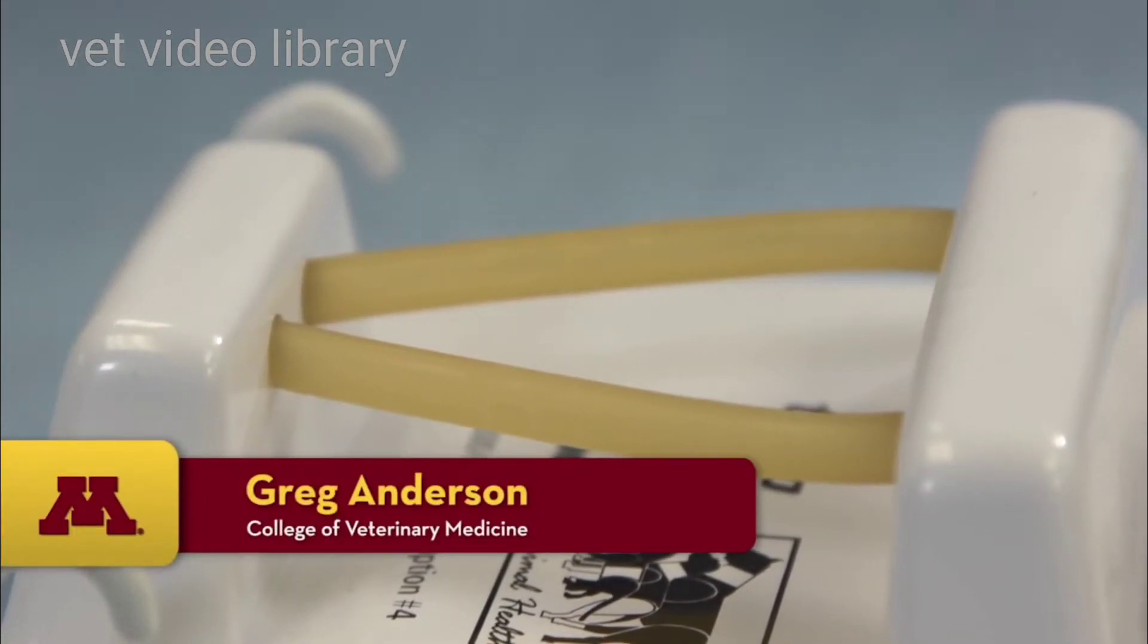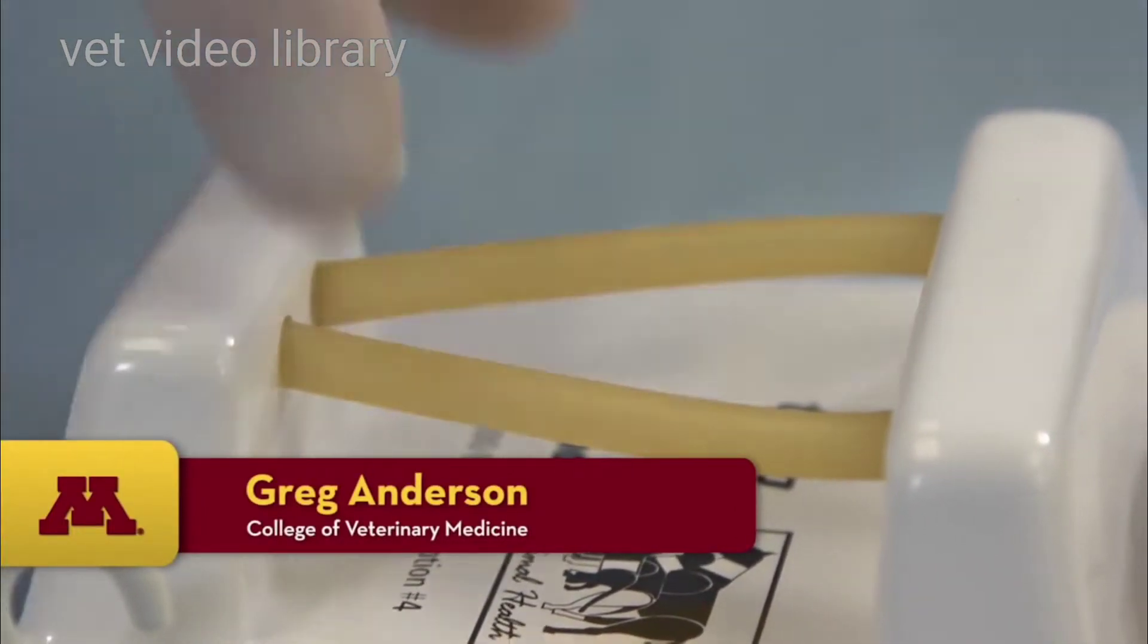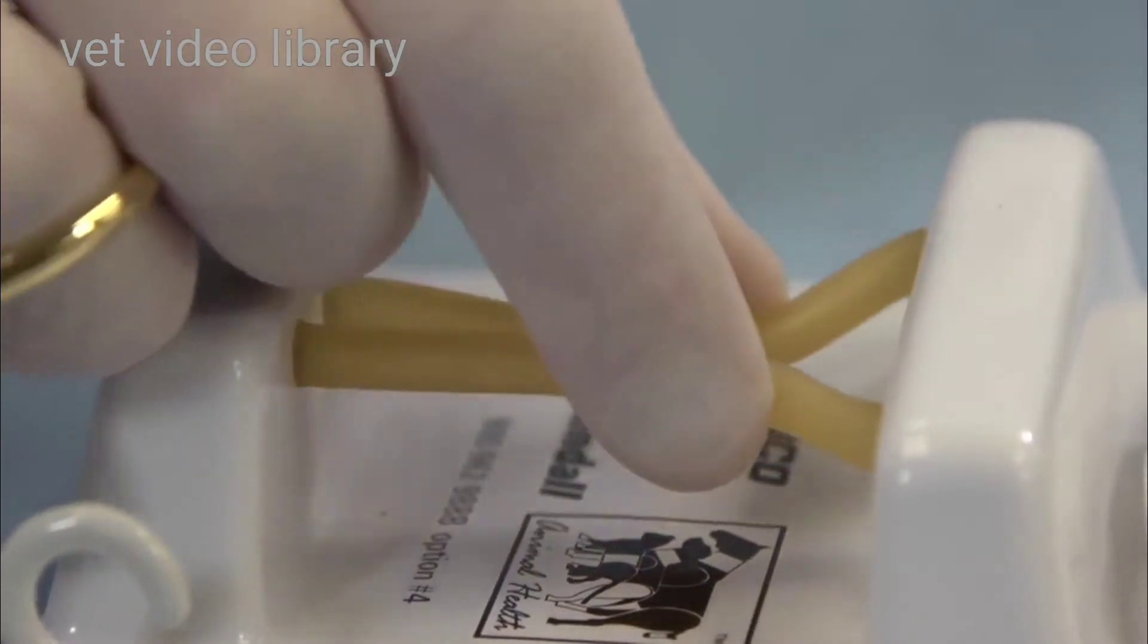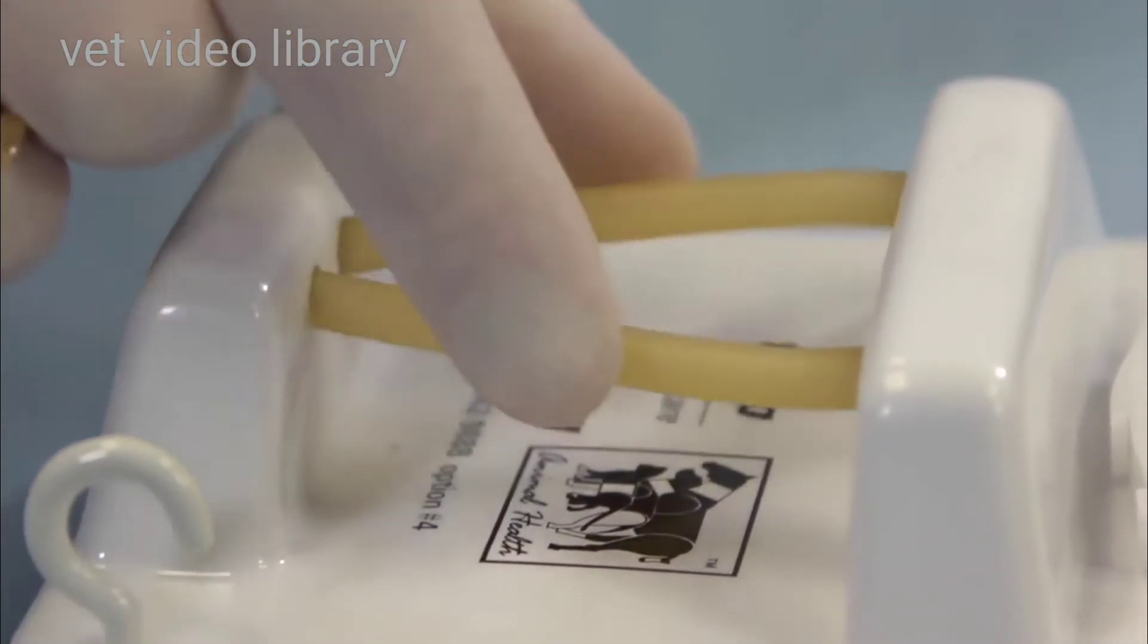This is another suturing model and this is nice because it has a feature on it that replicates tissue with a lot of tension on it.